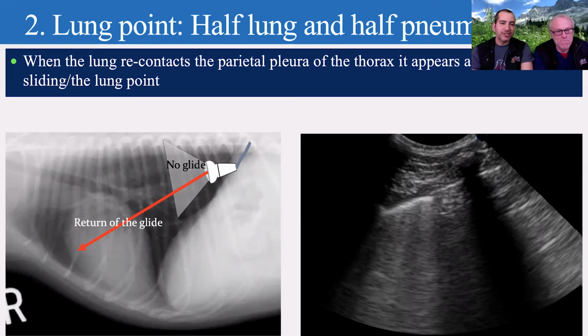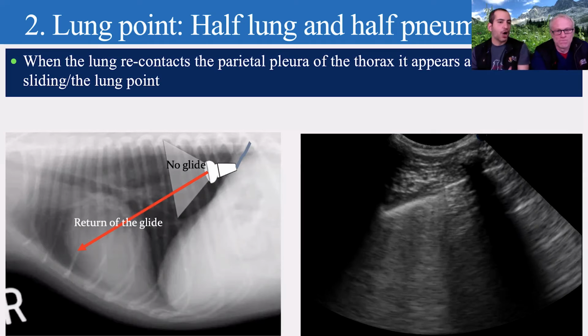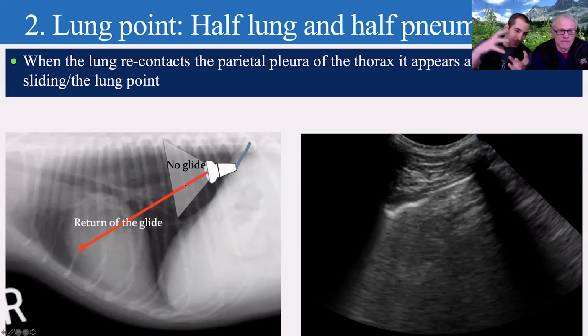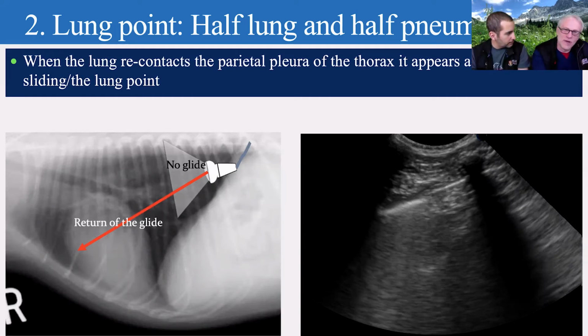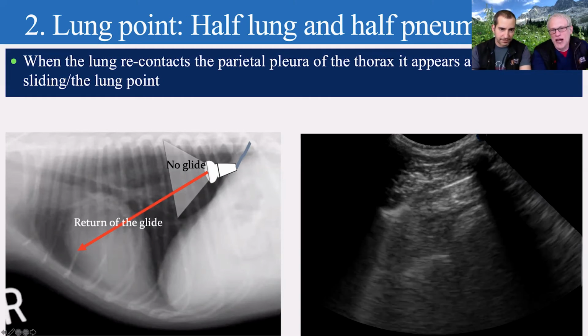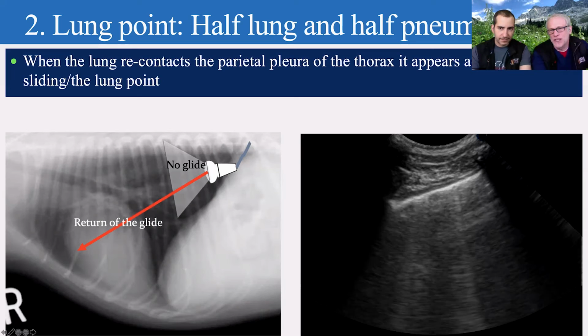All right. So if that patient is sternal or standing, Dr. Boysen, and I was at caudal dorsal, I see no glide, I should probably come cranial ventral because that's where the lungs are going to be squished to try to find that lung point. You nailed it, Dr. Chalhoub. And if I look at this image here, there's my rib shadow, there's my rib. I've got some pleural line here, and I don't see any shimmering over here at any point in time on this side of the rib. Yeah.